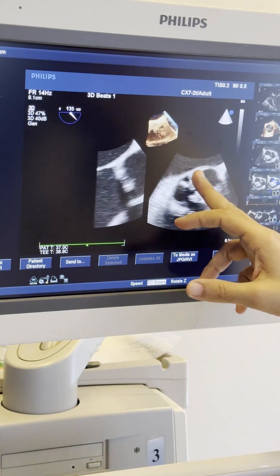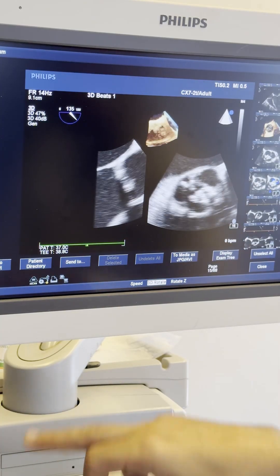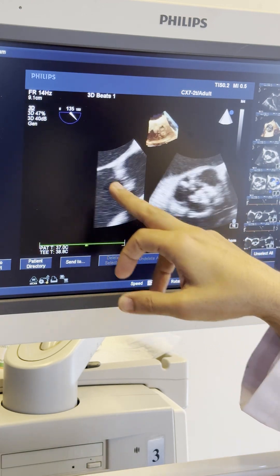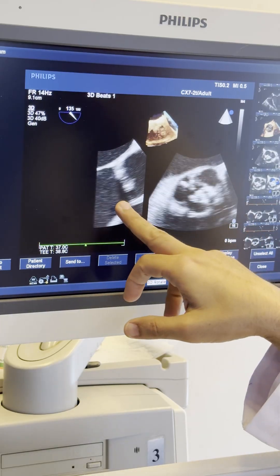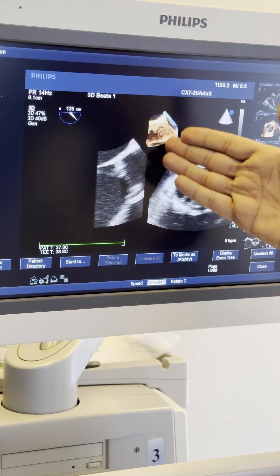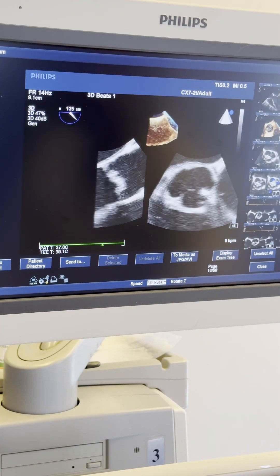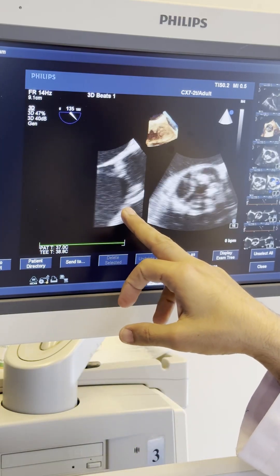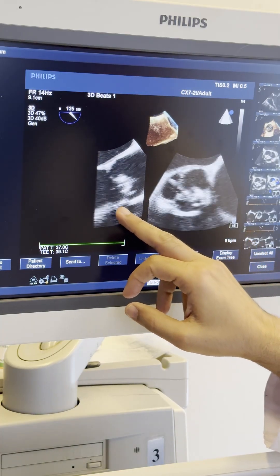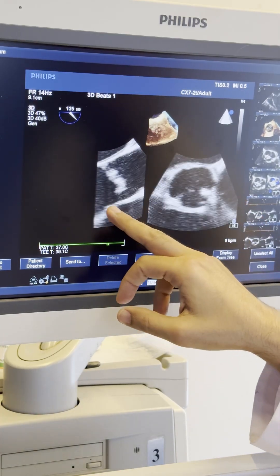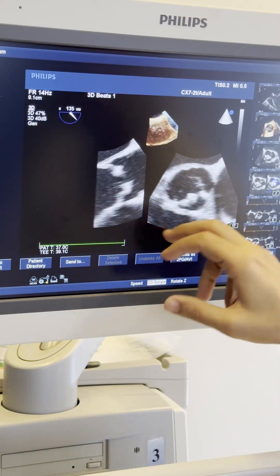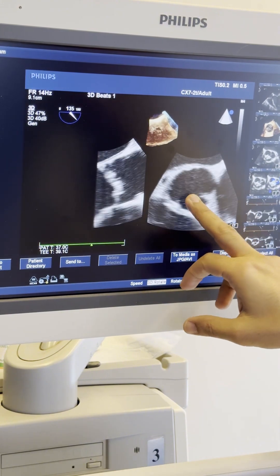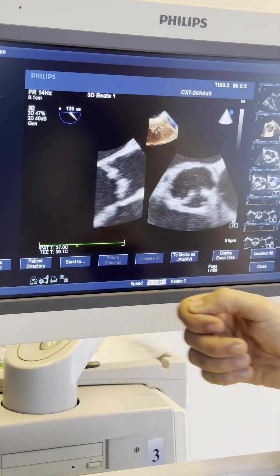This is the 3D zoom acquisition, but I usually prefer the two-image display rather than one image, as it allows me to know what is inside — in the long axis, short axis, or lateral elevation plane — so when I analyze this volume later I'll know what I can see. I manipulated the probe in and out to get a better view for the annulus. Before acquiring, I confirm I can see the annulus in this view. The short axis view also shows the left main takeoff, so I can analyze this volume later for the left main height.